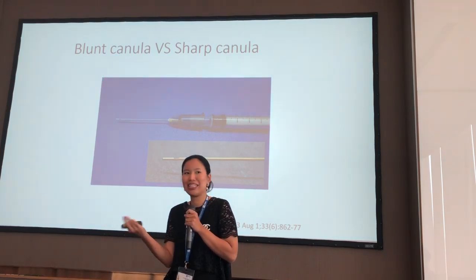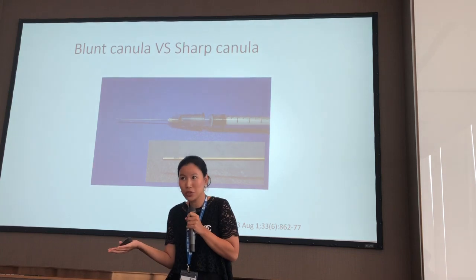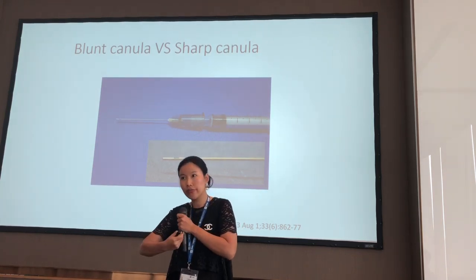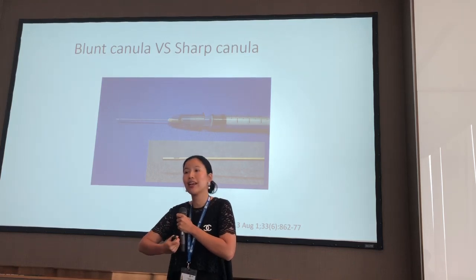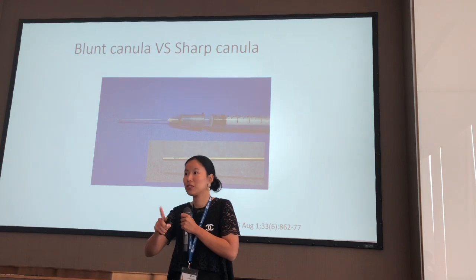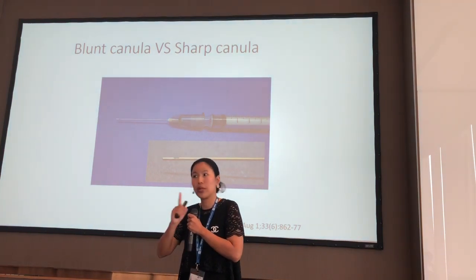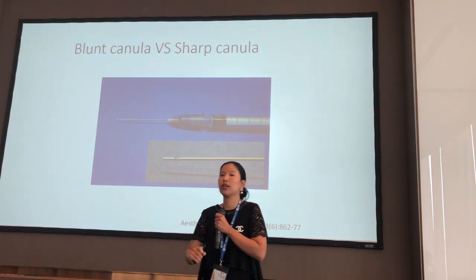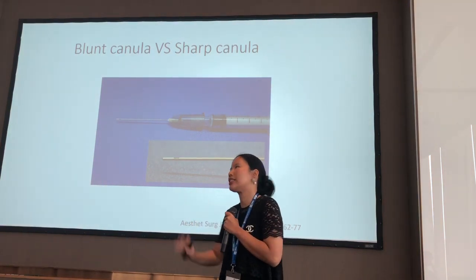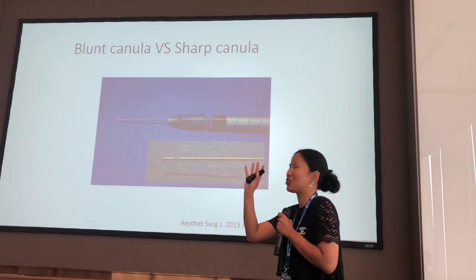It sounds funny, right? But it's true. If you use the blunt cannula and press yourself, and you can feel that it's sharp, do not use that. It's common sense, right? This is really the best way for picking the right cannula. Do not consider only the price. There are no good cheap things in this room. It's the truth.